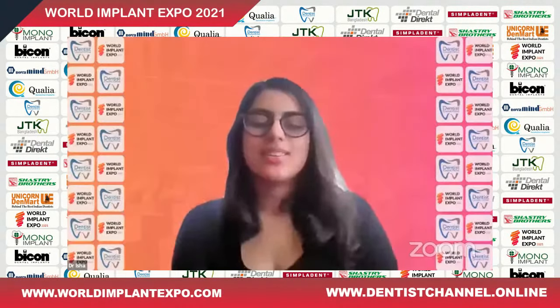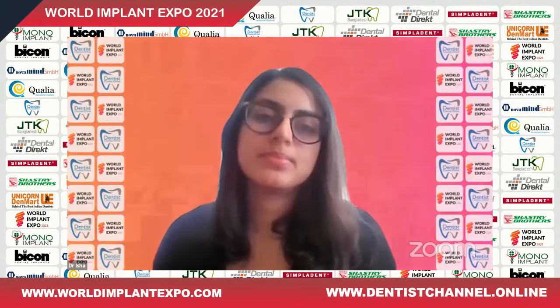Again, I'm not saying cement retained restorations are better than screw retained. Sometimes it's the total opposite, or most of the time screw retained restorations are beneficial, but cement retained is an option. It's a cheaper, easier, less technique sensitive option. So we can use it sometimes in certain cases. Any cement that is a long-term temporary solution would be good for implant dentistry.